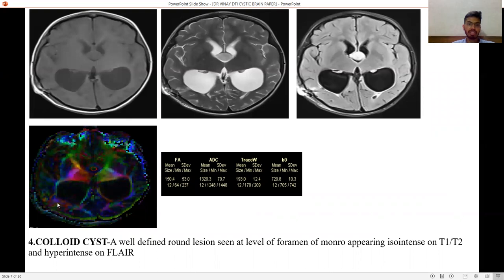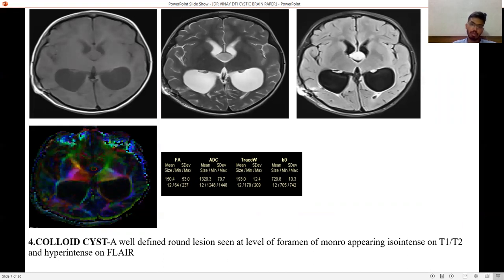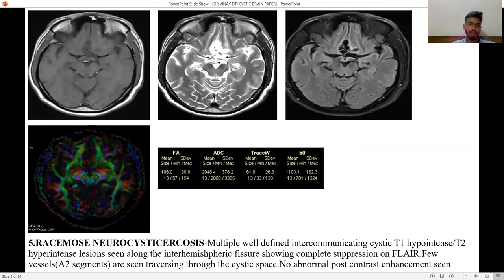Fourth is colloid cyst — a well-defined round lesion seen at the foramen of Monro, appearing isointense on T1 and T2, and hyperintense on FLAIR. FA value is around 0.150 due to the increased mucin content, which is slightly less than the epidermoid cyst.